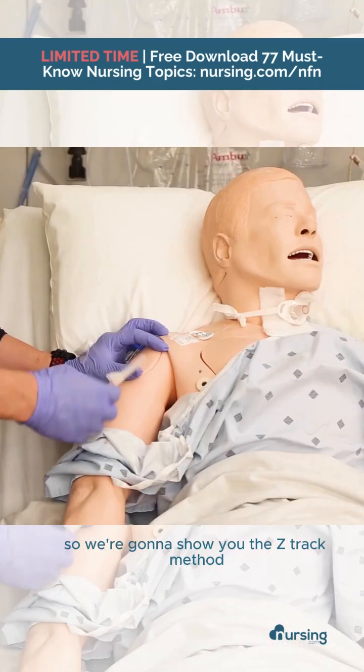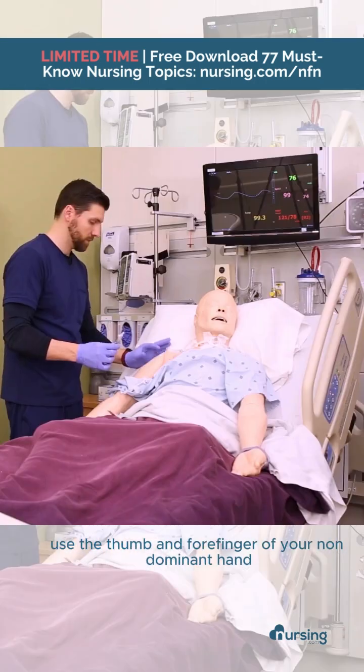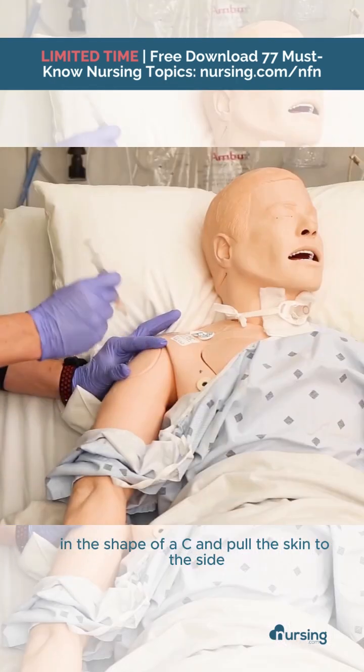We're going to show you the Z-Track method. Uncap your needle, then use the thumb and forefinger of your non-dominant hand in the shape of a C and pull the skin to the side.